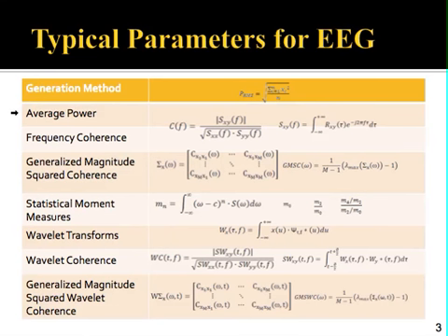So you can begin to appreciate the challenge in evaluating EEG data if you're going to try to do any kind of pattern recognition or identification of features. You can see that you're just going to be working with a huge amount of data, and so lots and lots of channels of data, lots and lots of numbers that you then have to have some scheme for reducing.